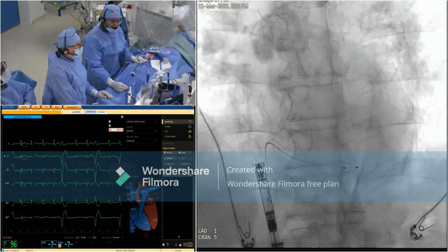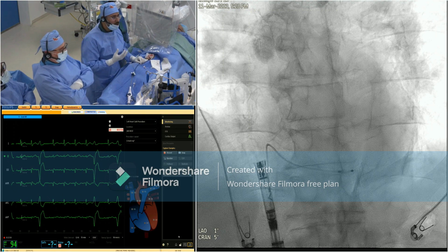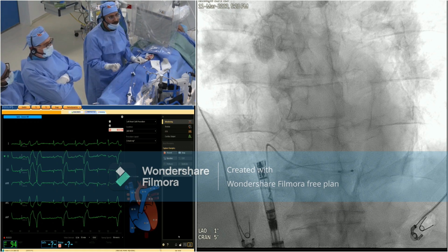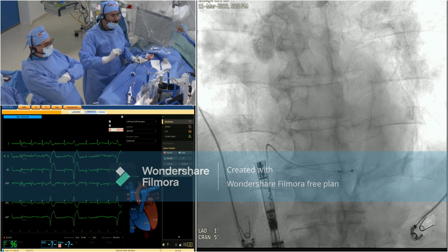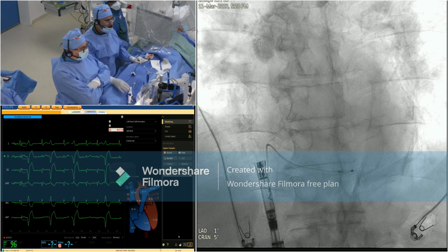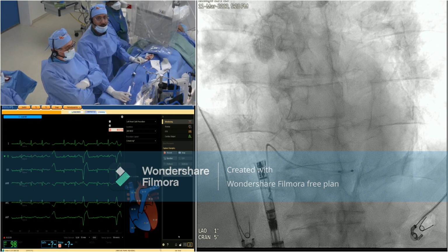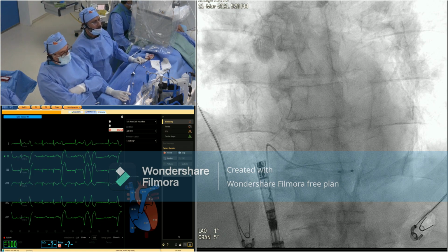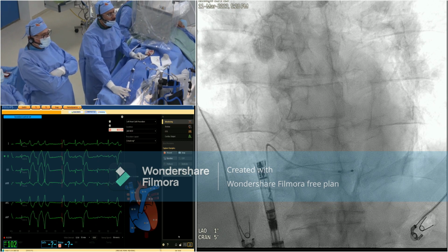So the first step is uploading the device. It's not like the Micra, when Dr. Yahya and Dr. Raid were showing you that the device becomes loaded with the Micra. So this is the first difference, and we had a chat about this, because the AVEIR leadless comes as a separate device, and you have to upload it. And you will ask why you have to upload it. Why do we have to upload it, Dr. Raid? Well, you know, this catheter will be used, the same catheter, for delivering the atrial leadless pacemaker. So instead of wasting 2 catheters, we upload it to the catheter, and we can use it again for the atrial lead or pacemaker generator when needed.